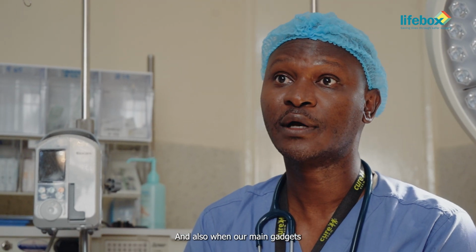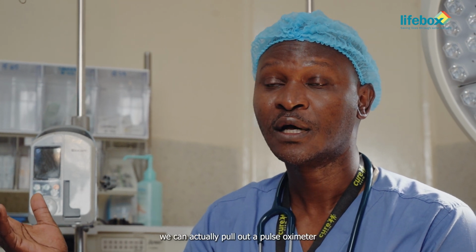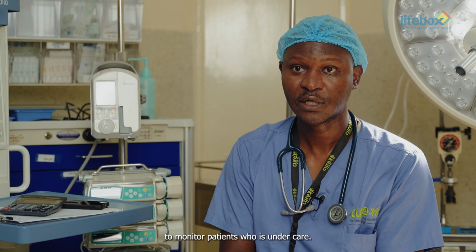And also, when our main gadgets malfunction, which happens a lot, we can actually pull out a pulse oximeter, pull out a Lifebox capnograph, and continue to monitor patients who are under care.